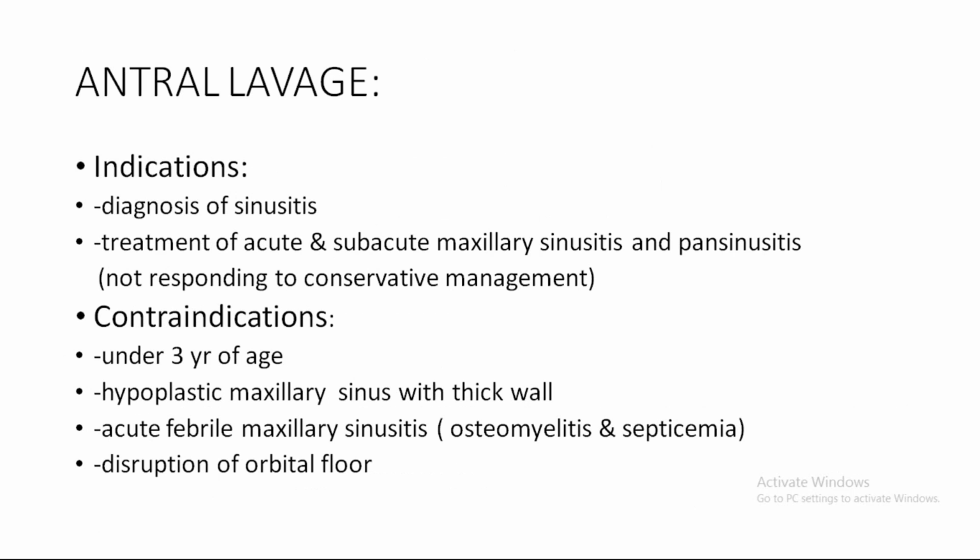Antral washout is another procedure, also called antral lavage or proof puncture. So indications are diagnosis of sinusitis. The returning fluid is collected in a kidney tray, and this returning fluid you can send for culture and antibiotic sensitivity.